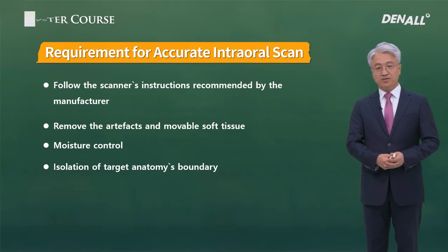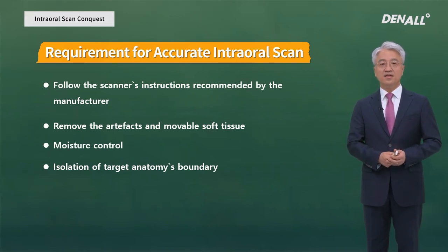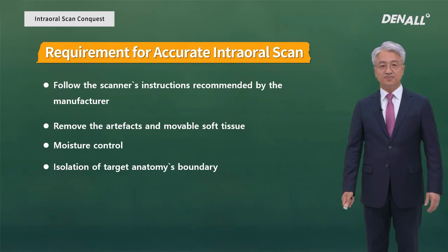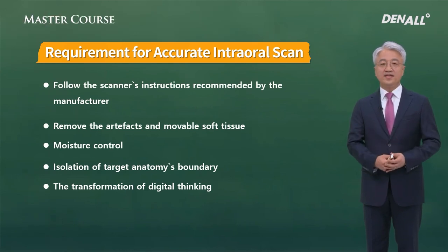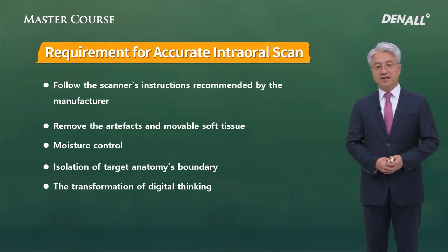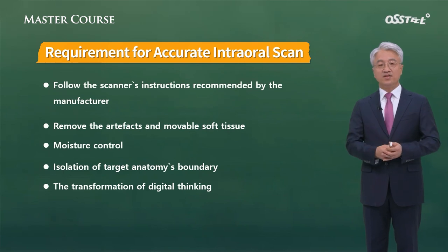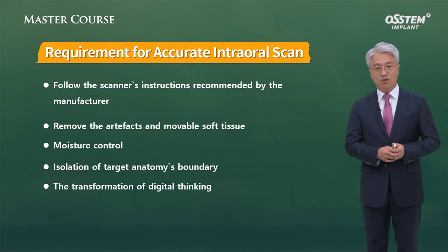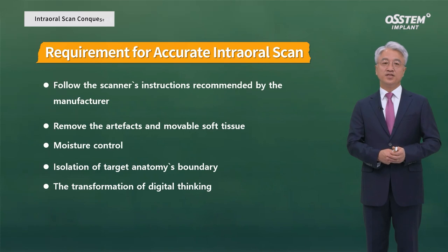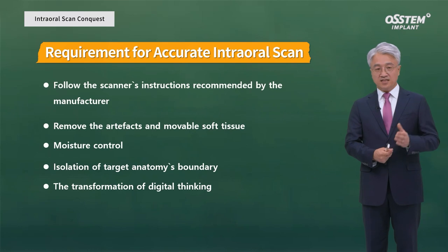When you work with a stone model, there were limitations on application. However, if you use digital scan data from an oral scanner, you can do different types of recombination in the prosthodontic stage, and you can look at different sections. If you think digital dentistry, I believe the clinical quality will go up drastically. You'd be able to perform different work within a short period of time with ease.